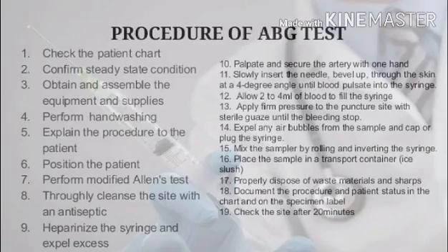Number 17. Properly dispose of waste materials and sharps. Number 18. Document the procedure and the patient status in the chart and on the specimen label. Number 19. Check the site after 20 minutes.